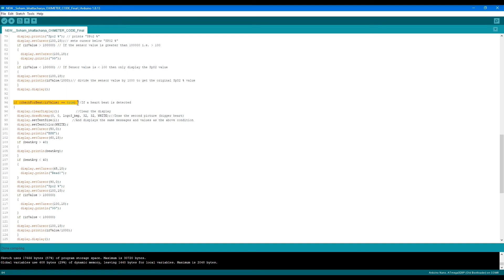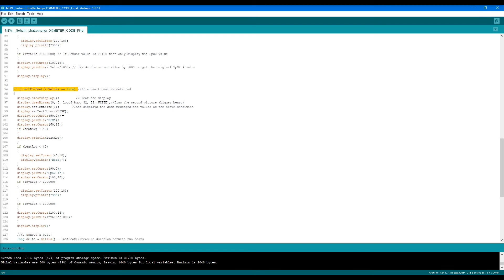Next we check with an if condition that if a heartbeat is detected, then we do the same thing of printing everything: BPM, SpO2, and all the values I described in the earlier if condition. We draw the larger bitmap image now.